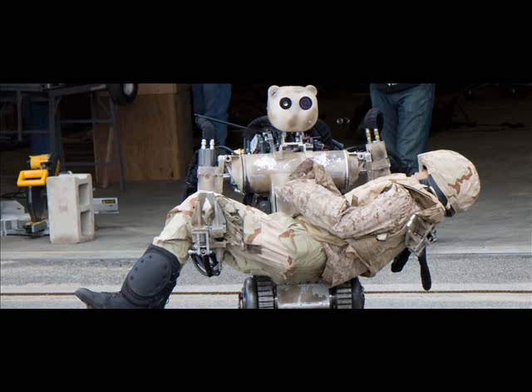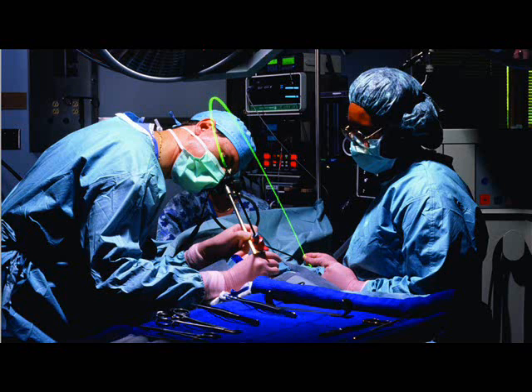Imris Incorporated's Simba surgical system will be the version of NeuroArm, the world's first MRI-compatible surgical robot, developed for worldwide commercialization. Medtech's ROSA is being used by several institutions, including the Cleveland Clinic in the U.S., and in Canada at Sherbrooke University and the Montreal Neurological Institute and Hospital in Montreal. Between June 2011 and September 2012, over 150 neurosurgical procedures at the MNI/H have been completed using robotized stereotaxy, including the placement of depth electrodes in the treatment of epilepsy, selective resections, and stereotaxic biopsies.